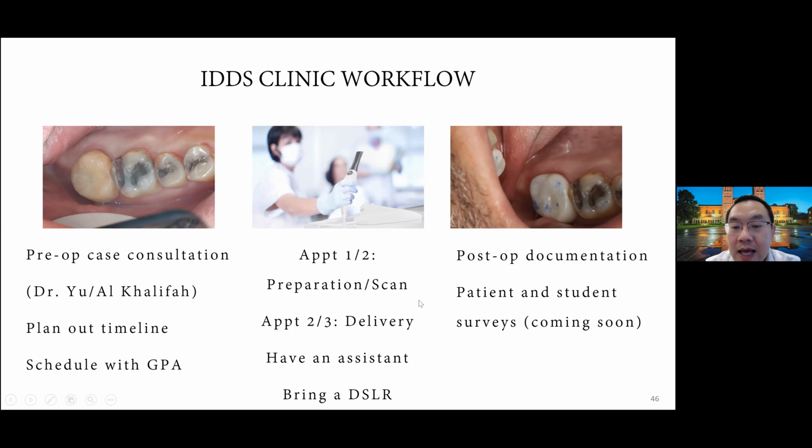Everything else happens between your restorative faculty and the lab, which is right now manned by the advanced prosthodontics faculty, Dr. Danny Chow. They're going to do the design, milling, and finishing for us. I highly recommend that you bring a student assistant. That will help the process along a lot faster.